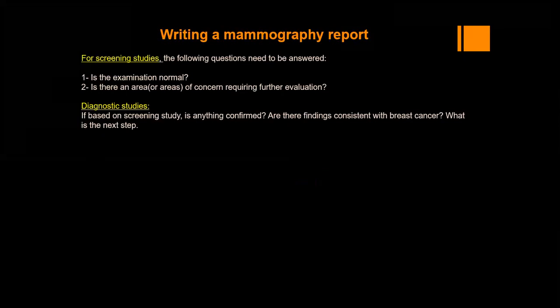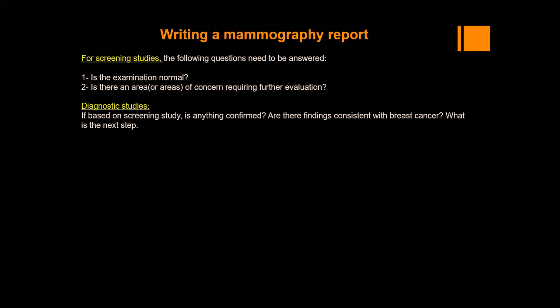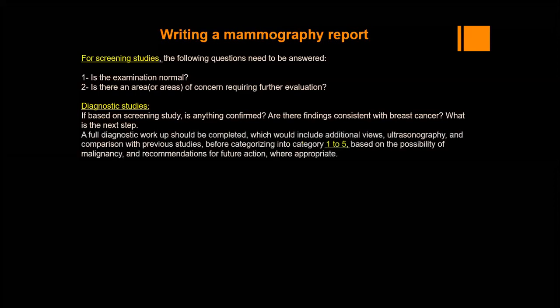Is the examination normal, or are there any areas of concern requiring further evaluation? That is it. This is for the screening. For diagnostic, which is based on a screening study: is anything confirmed? Are the findings consistent with breast cancer? What is the next step?